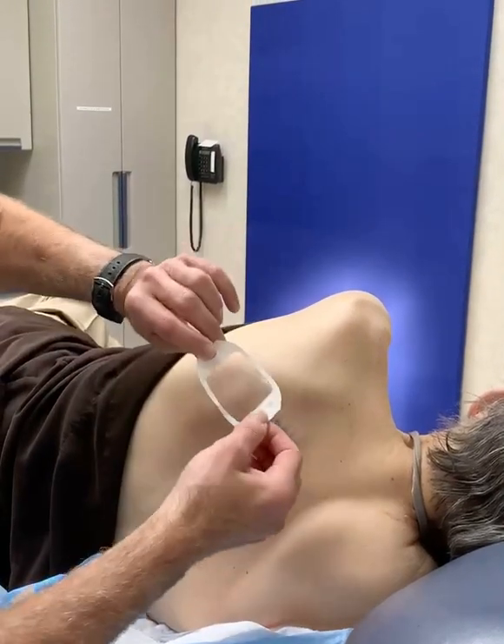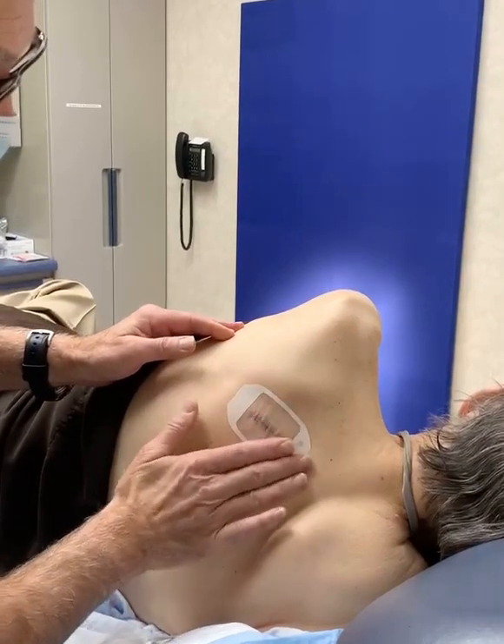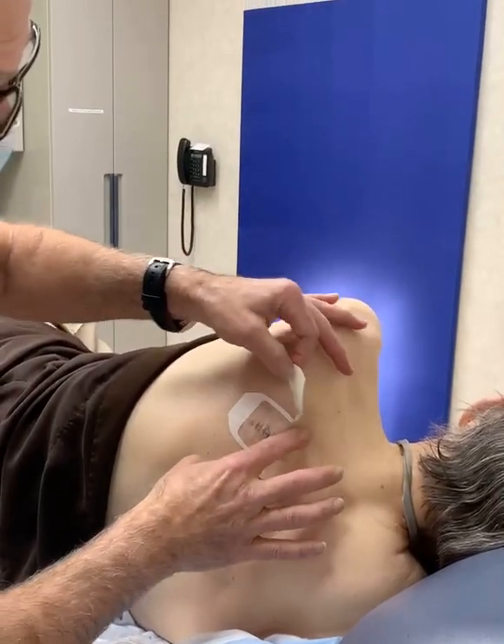This is now sticky. You'll lie it on top of the wound, pat it smooth, and then you'll just peel the rim. Just make sure that it doesn't lift up as you go.